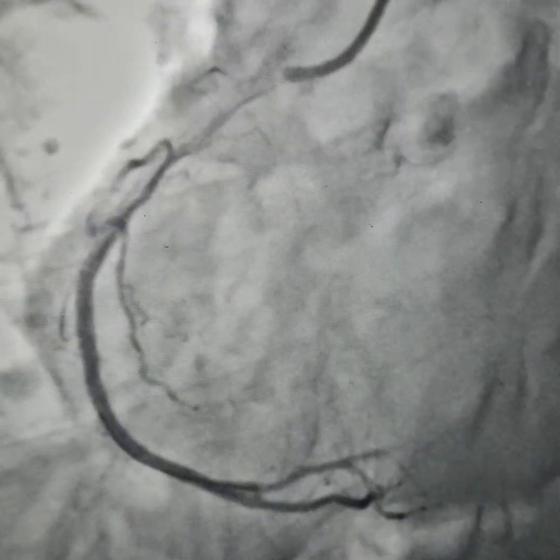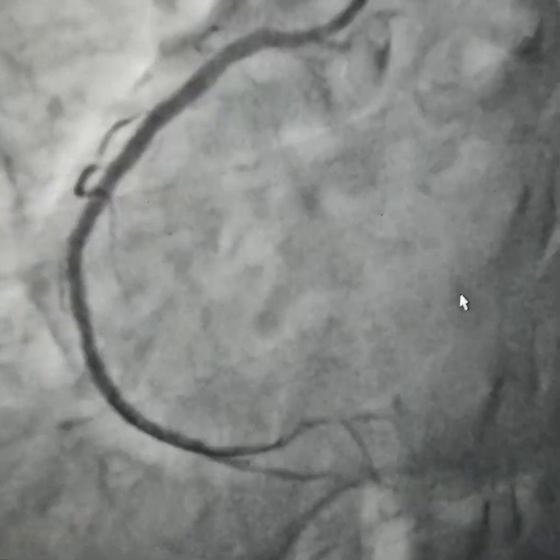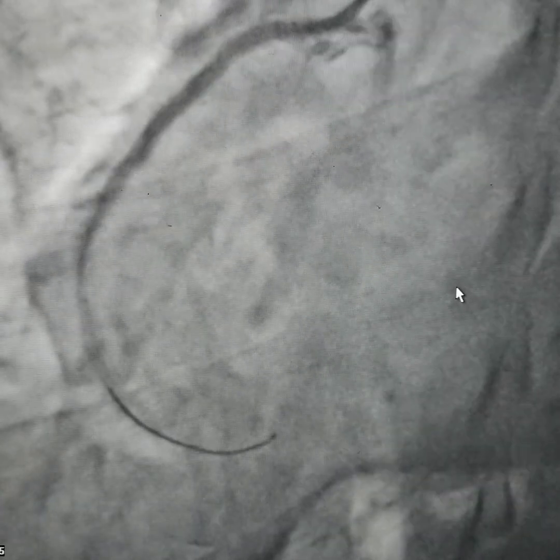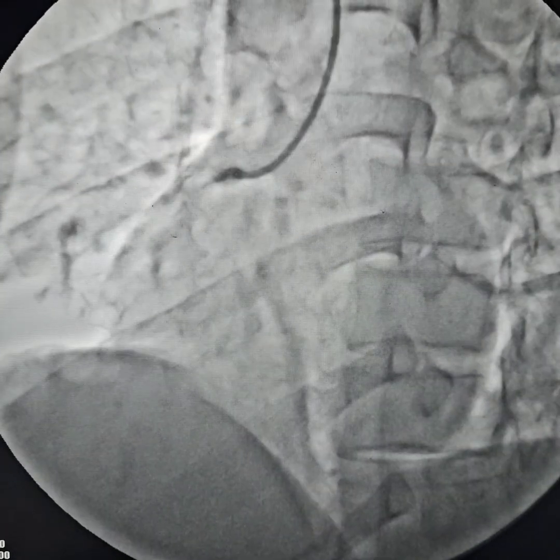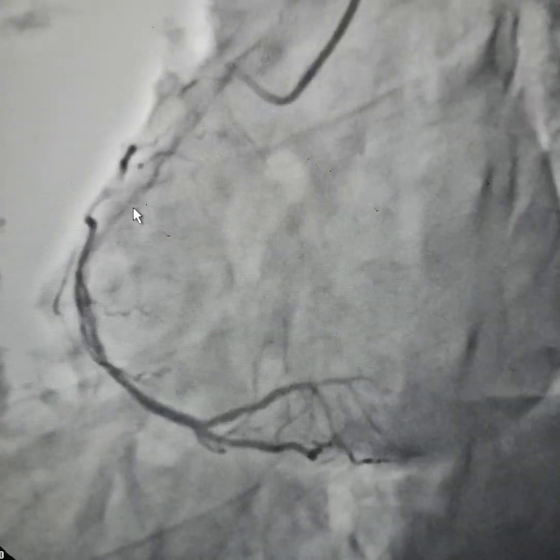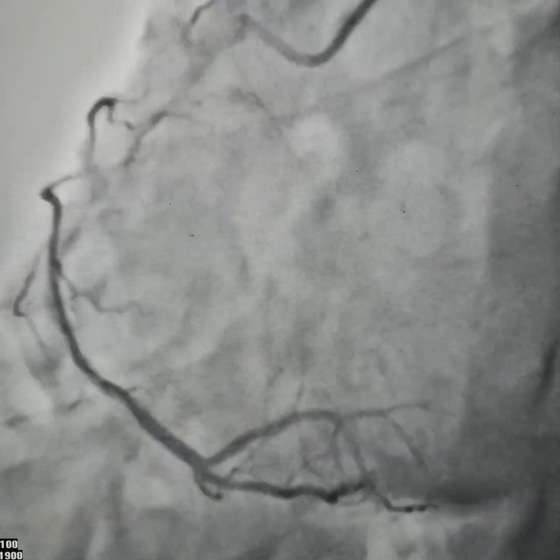This is the final result — a wonderful artery that has opened up. Let us compare the first image and the final result. Originally, it was not a very good artery — a very tight 90% lesion here, and the rest about 70 to 80%. And now the final result.